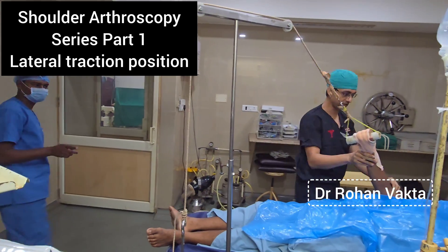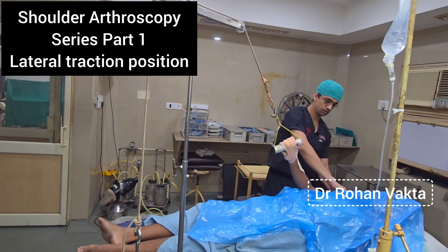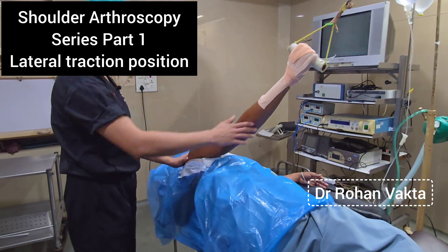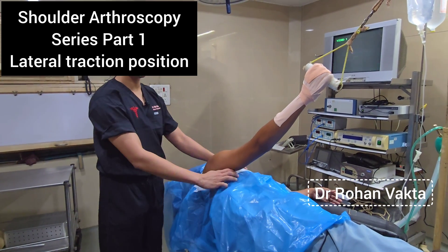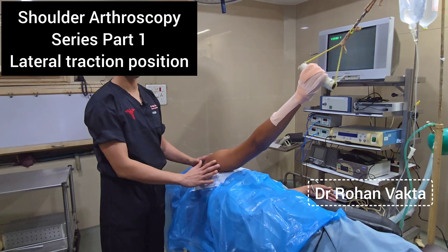As you can see, the hand is now attached to the traction. We will now give the lateral position. The shoulder traction is applied and the entire area is covered with the plastic drape. We have sealed the plastic all around with micropore, so during surgery the fluid will not go over to the patient's chest or abdomen.